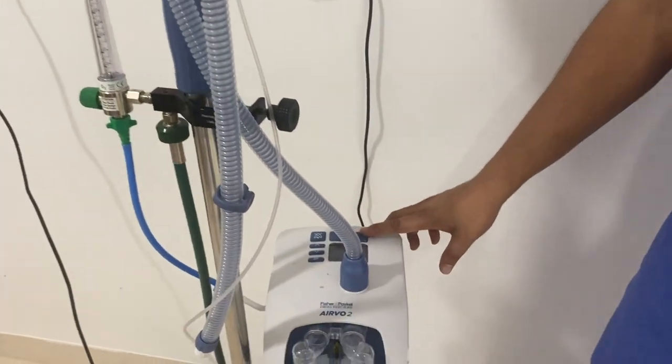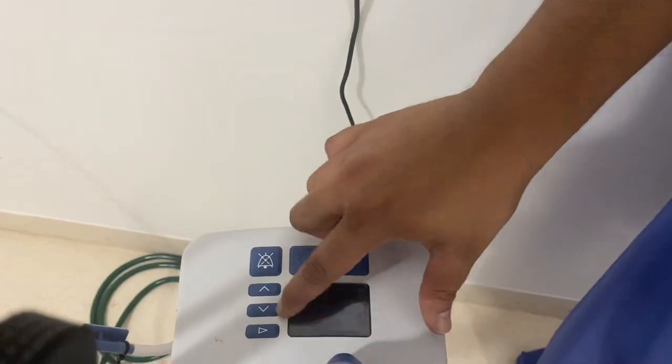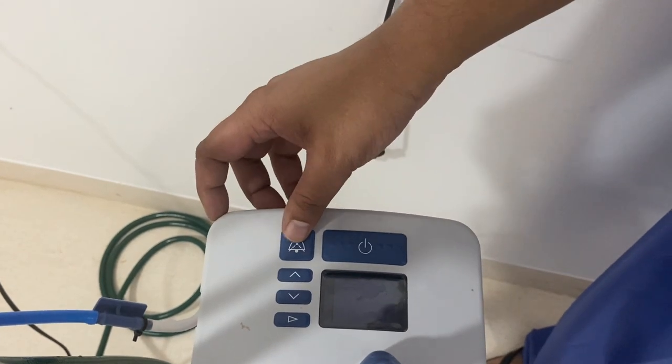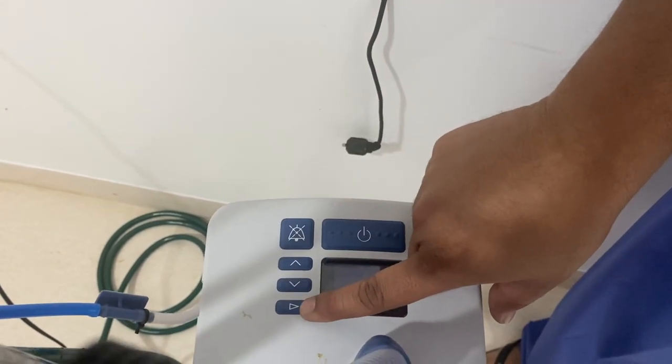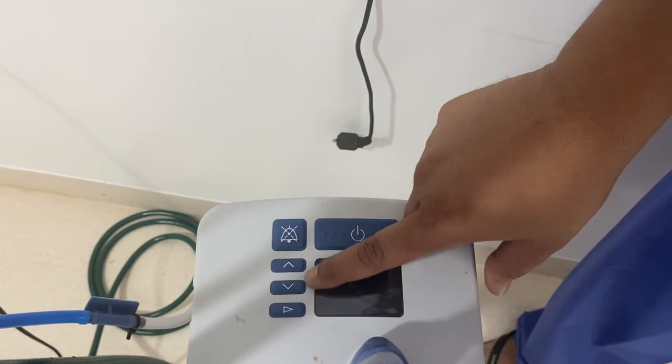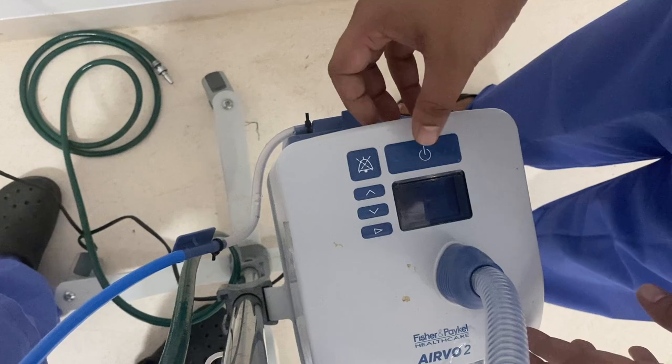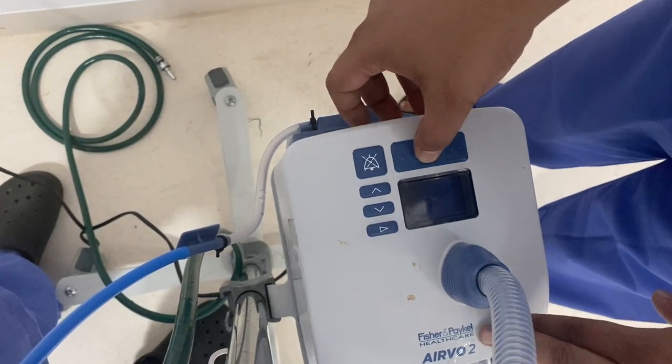Now coming to our panel: this is the display screen. This is the power button. This is the alarm mute button. This is the mode button. These are the two buttons to increase or decrease the values that have to be set. To switch on the machine, we need to press the power button for 5 seconds.